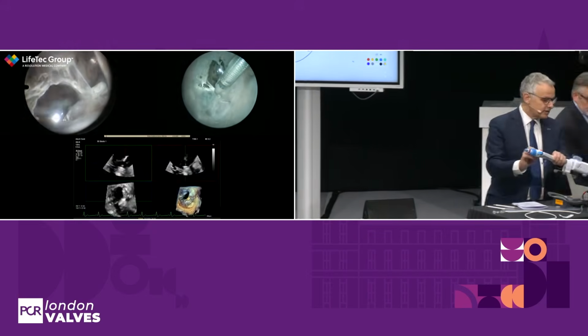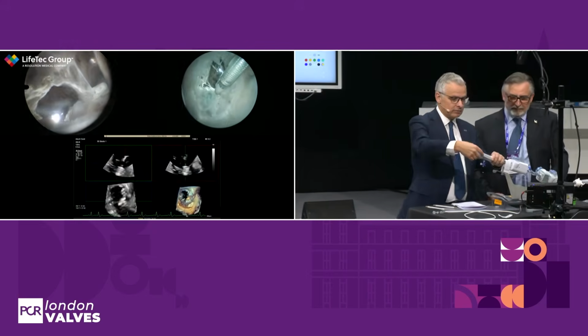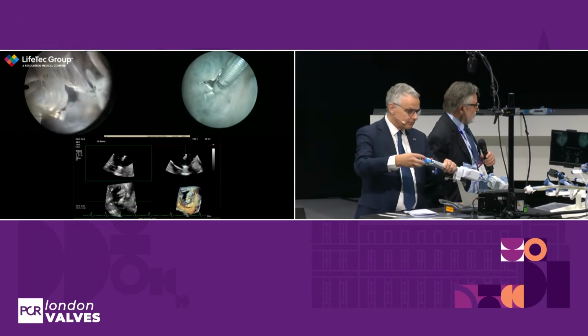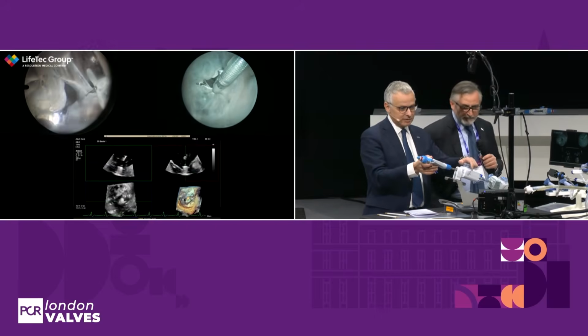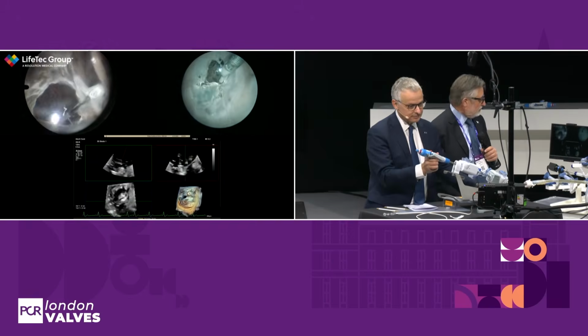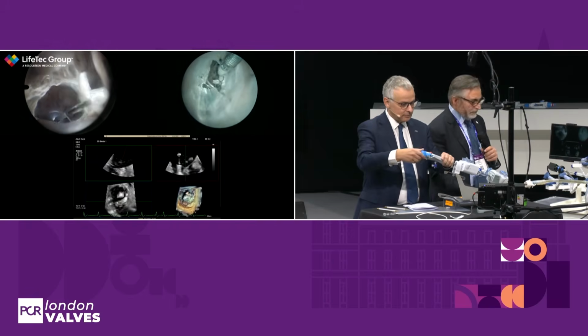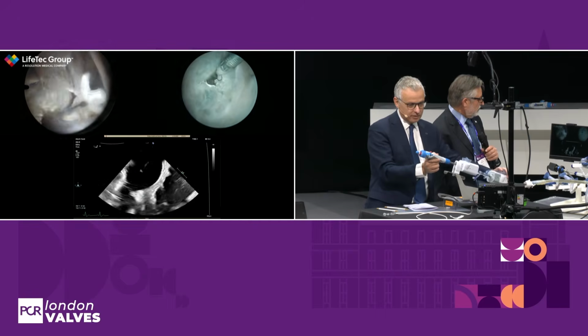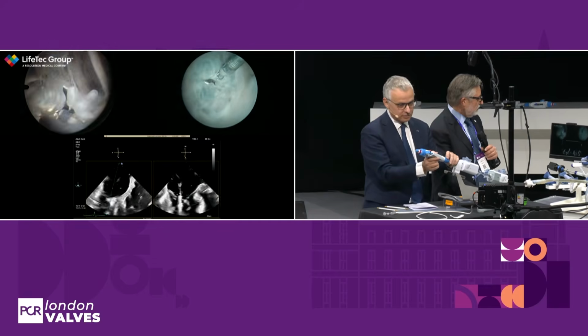So for this reason, my friend, I think we should raise the grippers, invert, and pray. Because usually it's not always easy to disentangle, but we'll try. We'll try, and we are good. We are good boys.